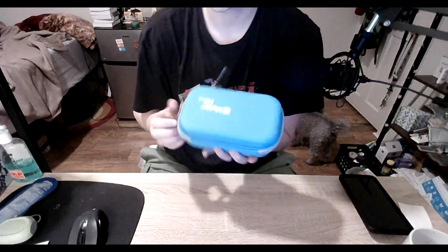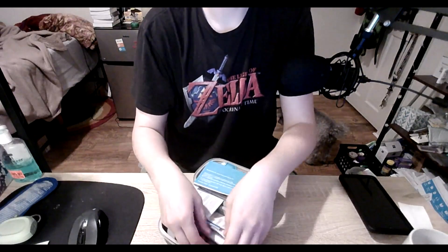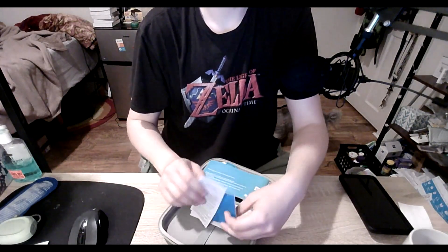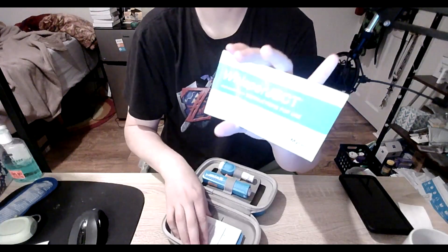Hello, I'm just going to do a little demonstration on not necessarily the actual injecting, but using the autoinjector that I have for my MS medication. This is what we've got going here. It comes in this little bag here that holds it all together, and it has this pamphlet that gives you a little bit more information.